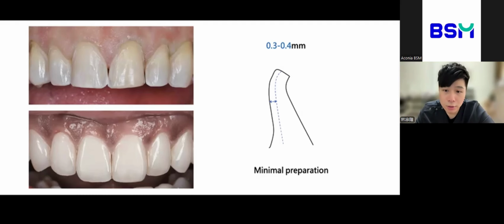And under space-limited conditions, traditional glass ceramic becomes quite restricted. In this situation, zirconia veneers can be a very good option. The bonding procedure is simple, the surface treatment is easier, and clinically, it can also save a lot of time for dentists and for us technicians.